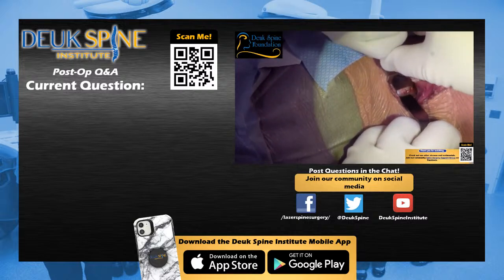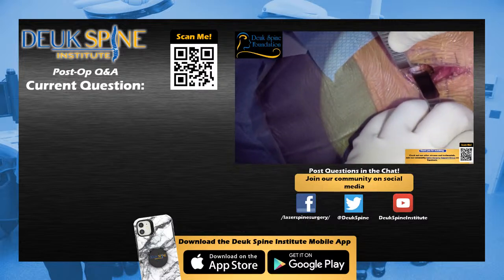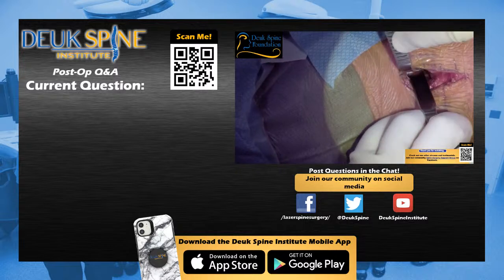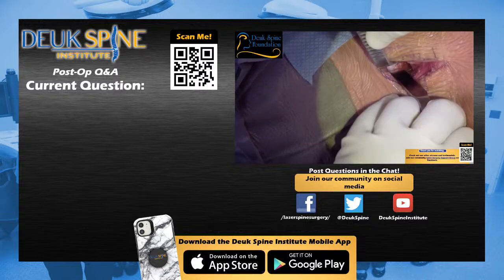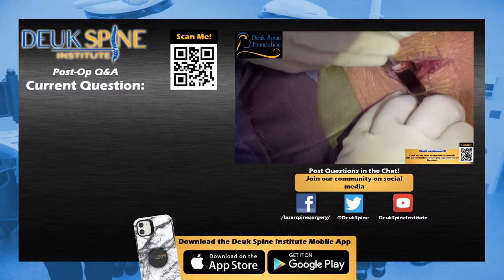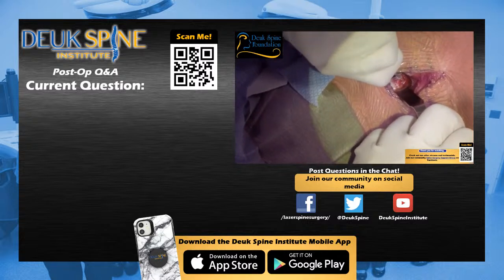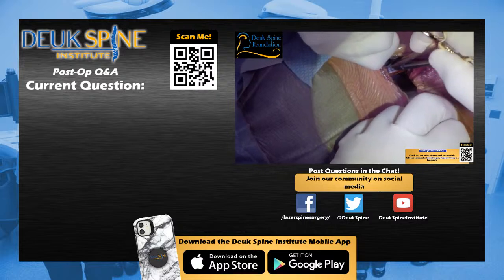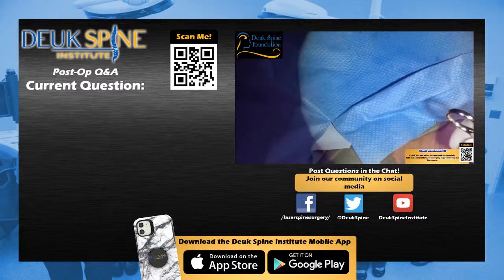I recognized it right away in the surgery when we started taking x-ray pictures, and we could only see the top of the spine. So overall, challenging case. This is honestly the deepest neck I think I've ever done. We used a 55 millimeter long retractor blade and a 60 millimeter long retractor blade medially, which is normally, I'm at 40, 45. On a skinny patient, 30, 35. On an average patient with kind of a thicker neck, 40, 45. But this was a 55, 60. So he almost had us at the longest blades we have for retracting.